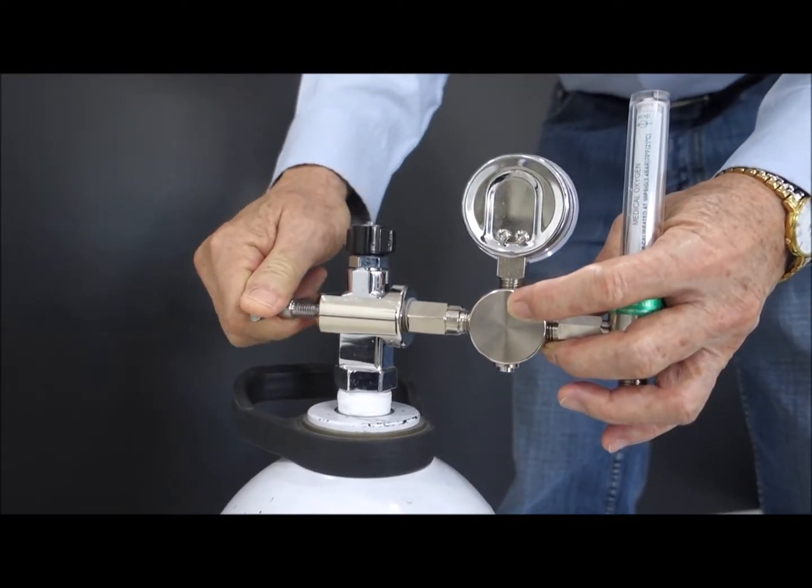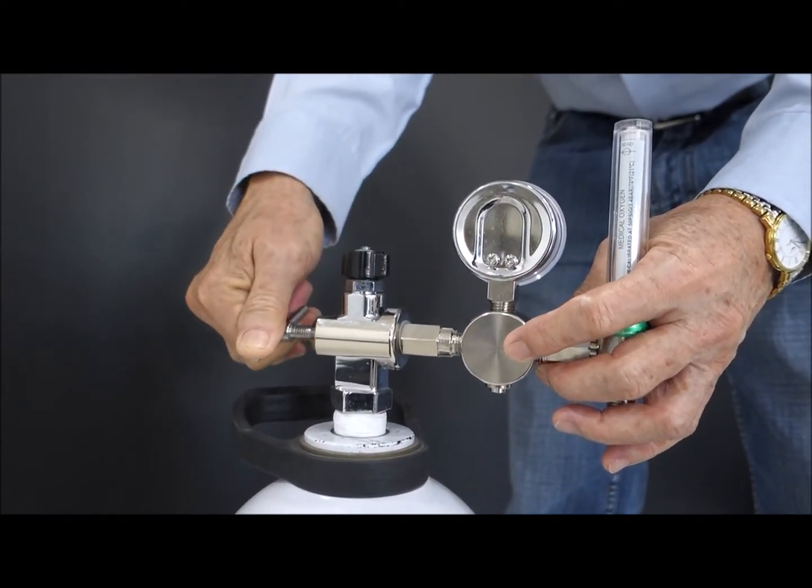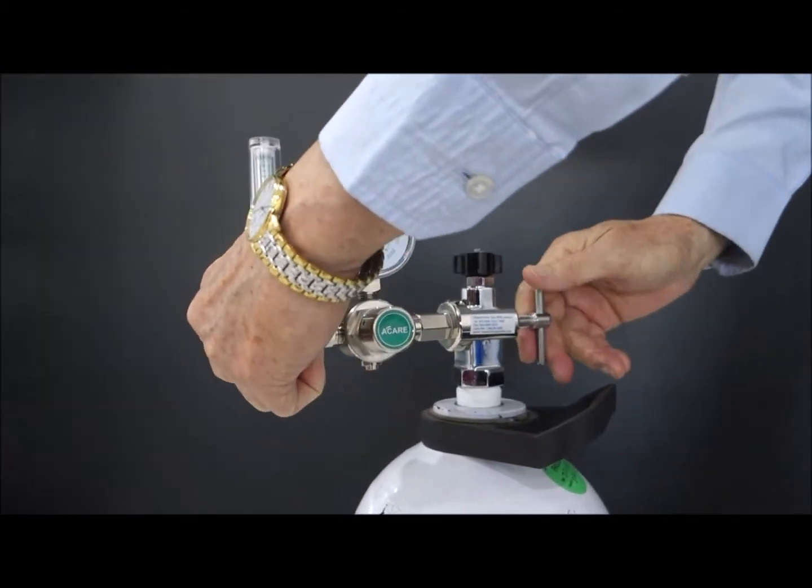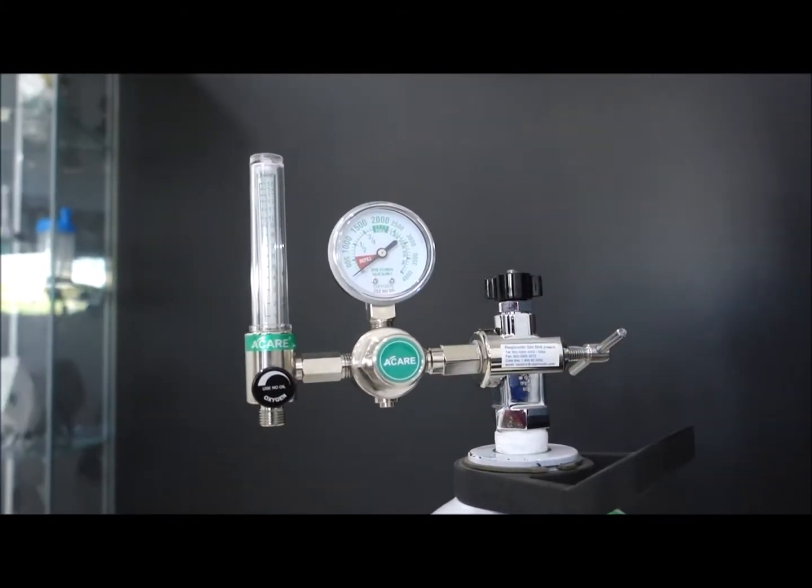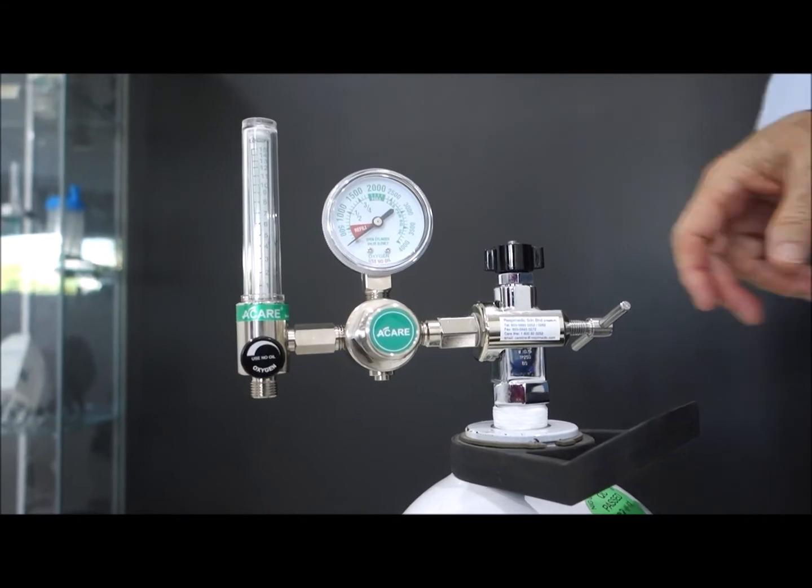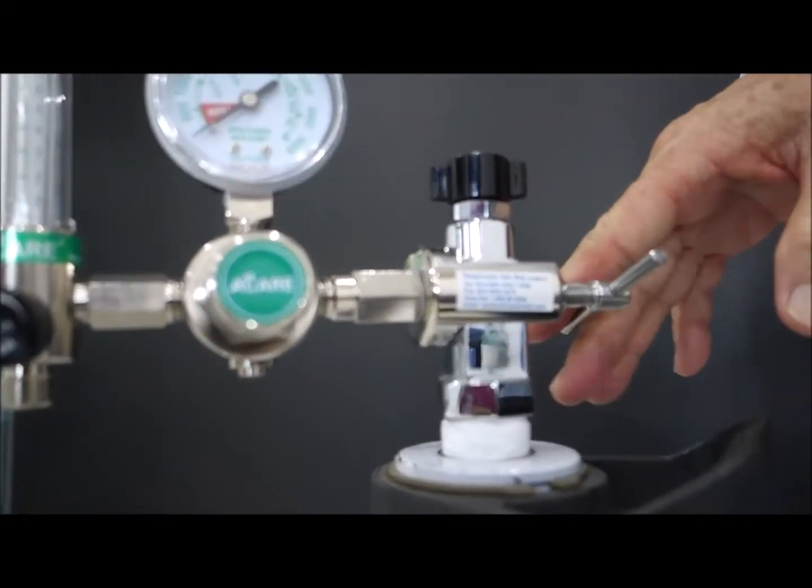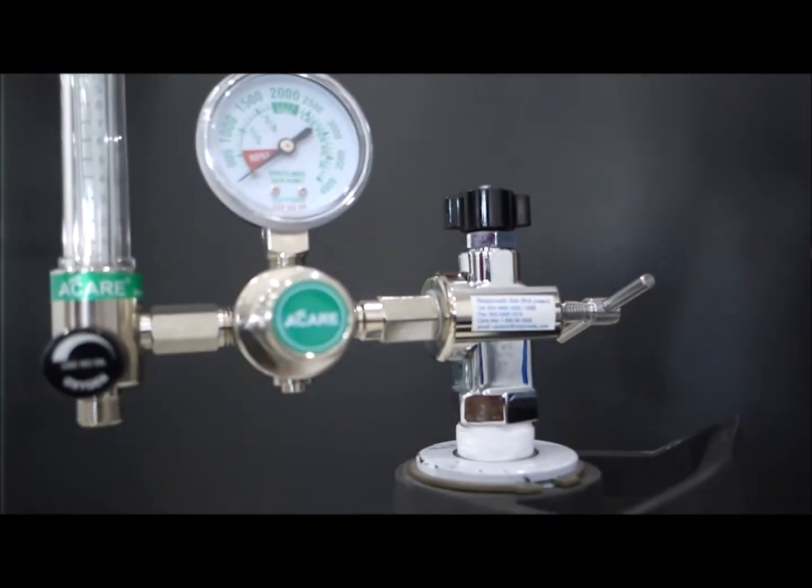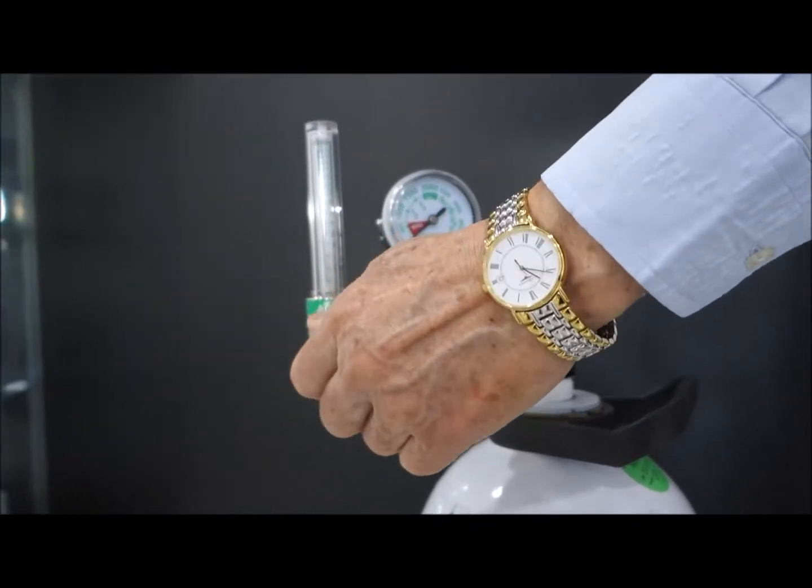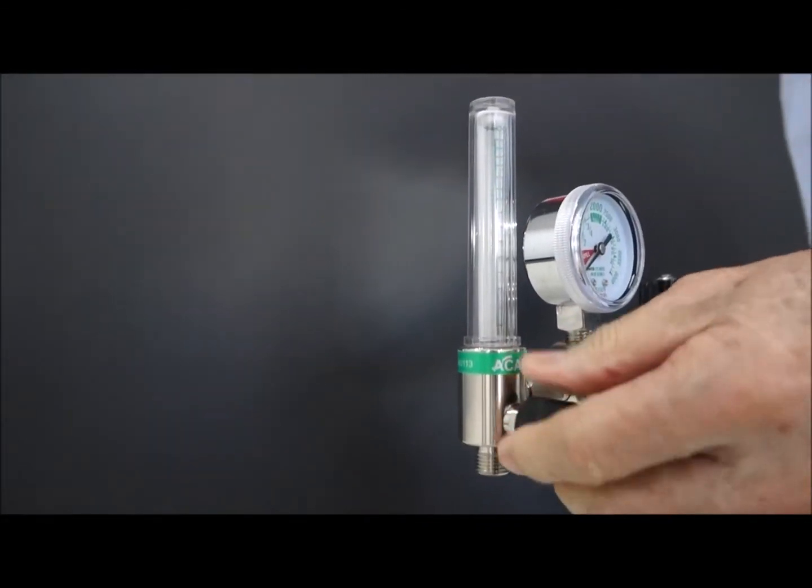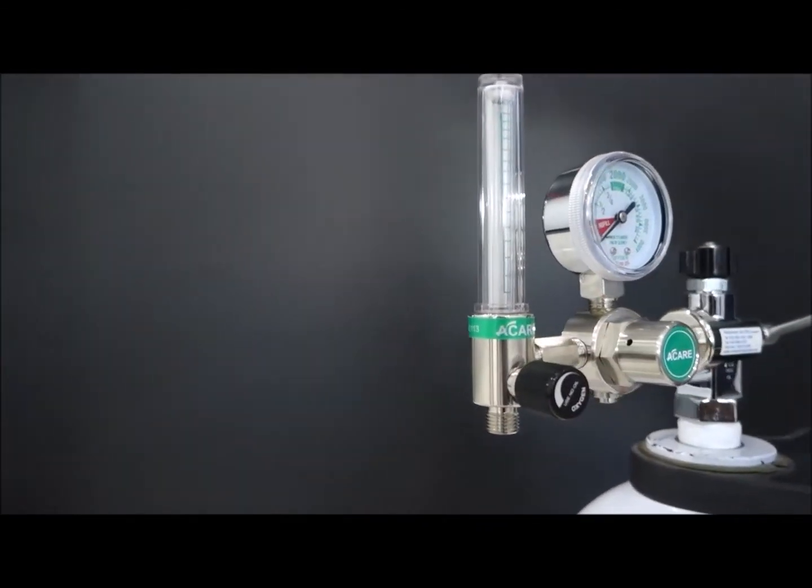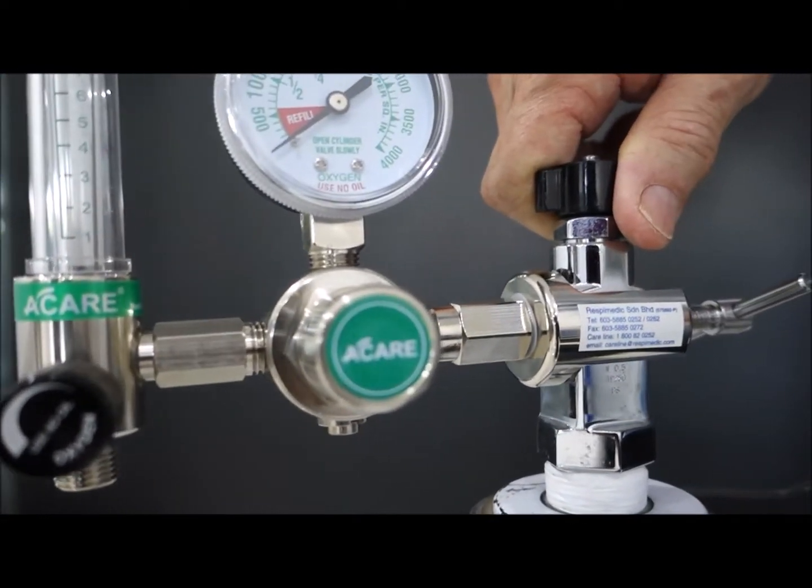So tighten as usual is clockwise. And then once you tighten it, you can position it anywhere and then tighten it. So the next thing after you tighten the regulator onto the cylinder valve, make sure the flow meter is turned off if you're not using. And then, turn on slowly, gently turn on the cylinder valve.